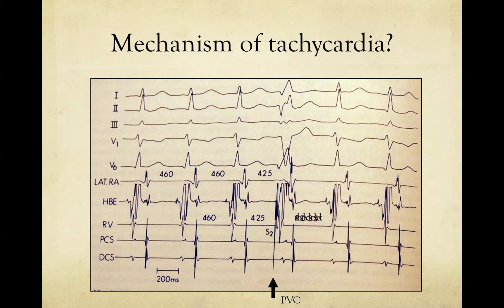That's right. And then with that rate, I'm trying to think, ORT in this patient with a rate of 130, would that be more like a PJRT type picture? That's exactly right. That's a very, very astute comment, Dr. Capon, which we're happy to hear since you have 10 minutes left as a fellow. But that's great. That's exactly right.